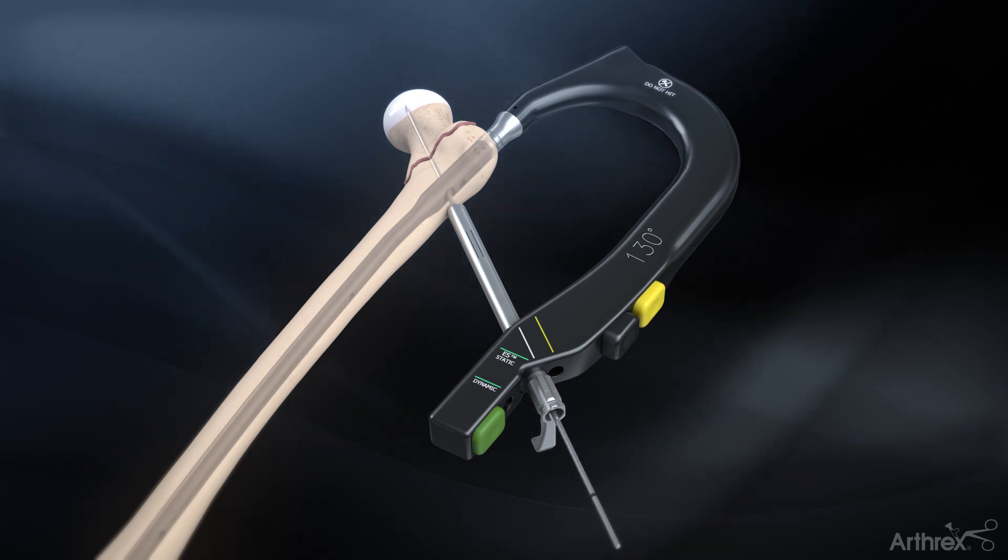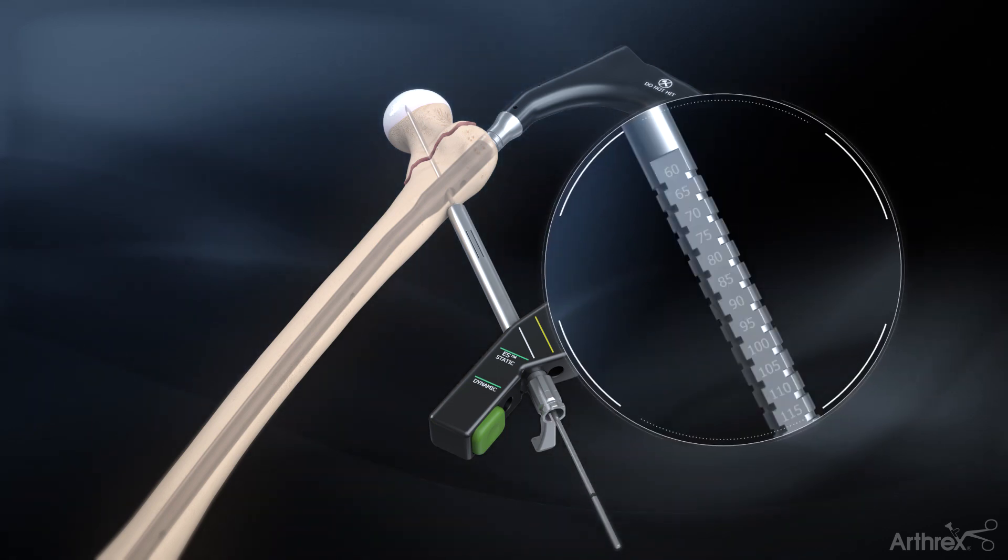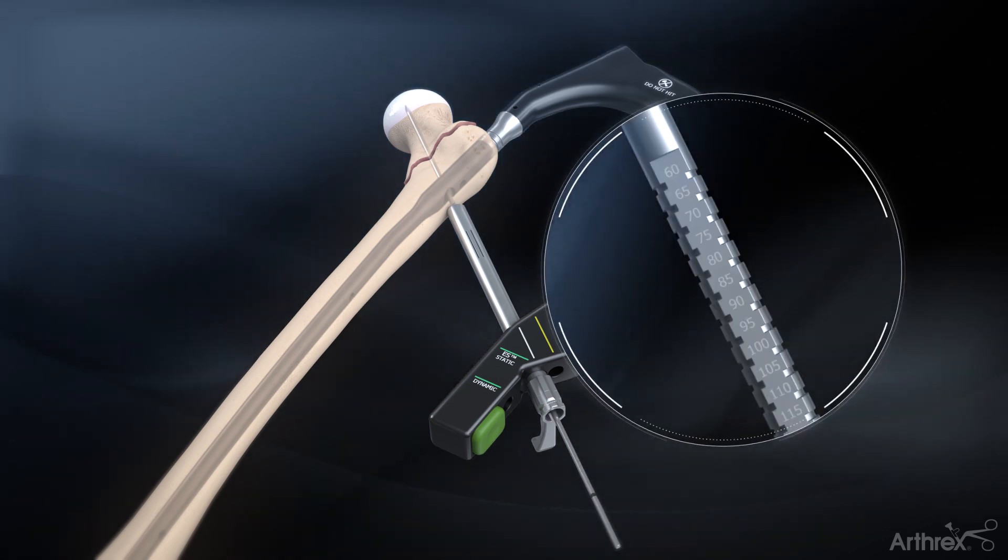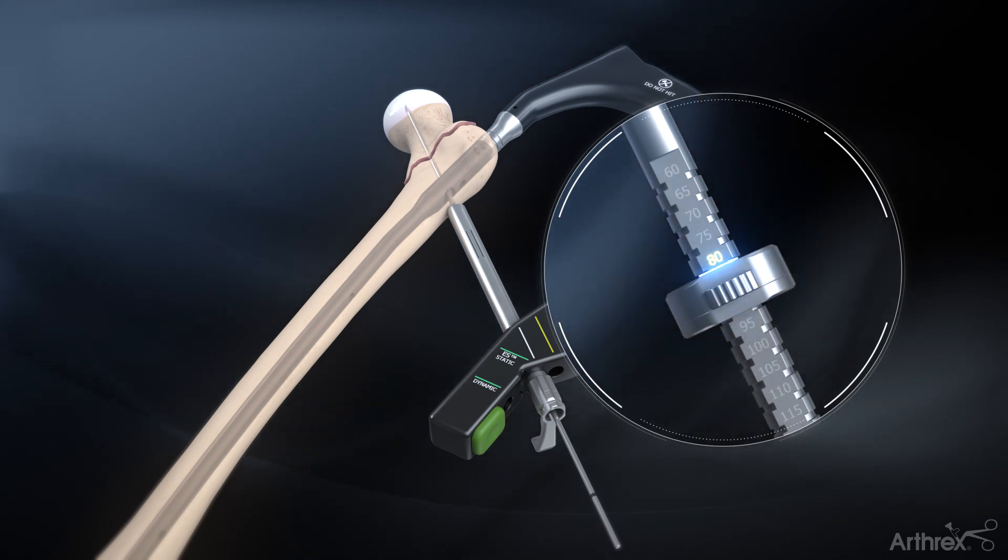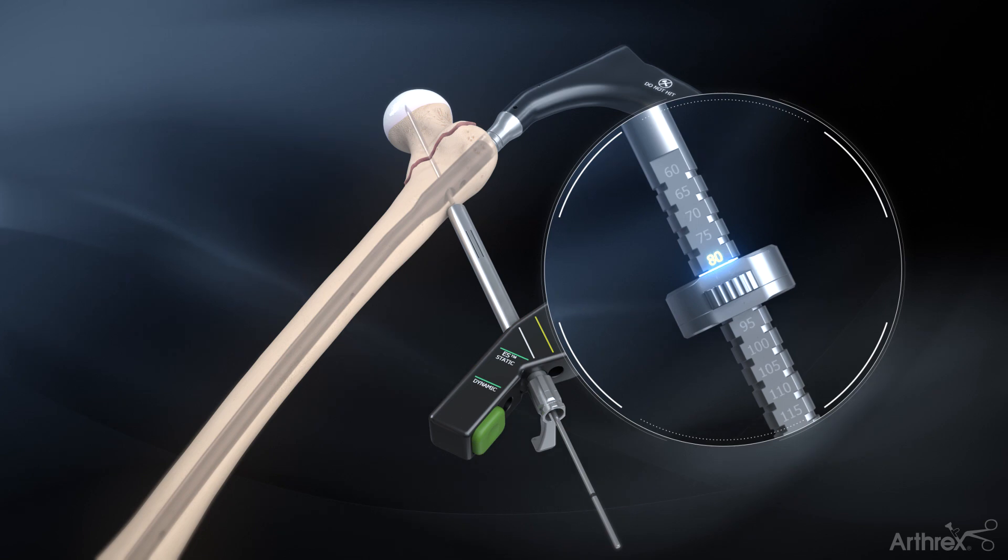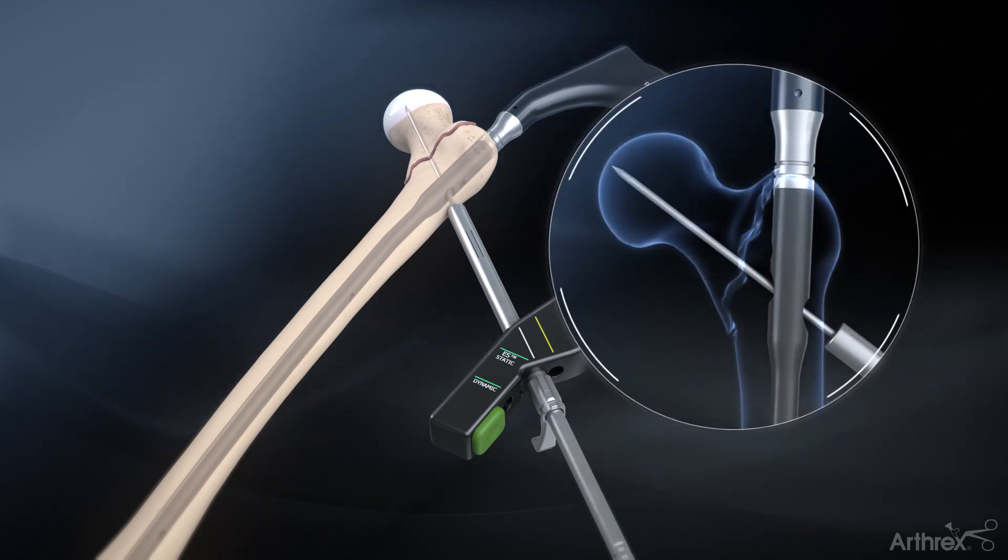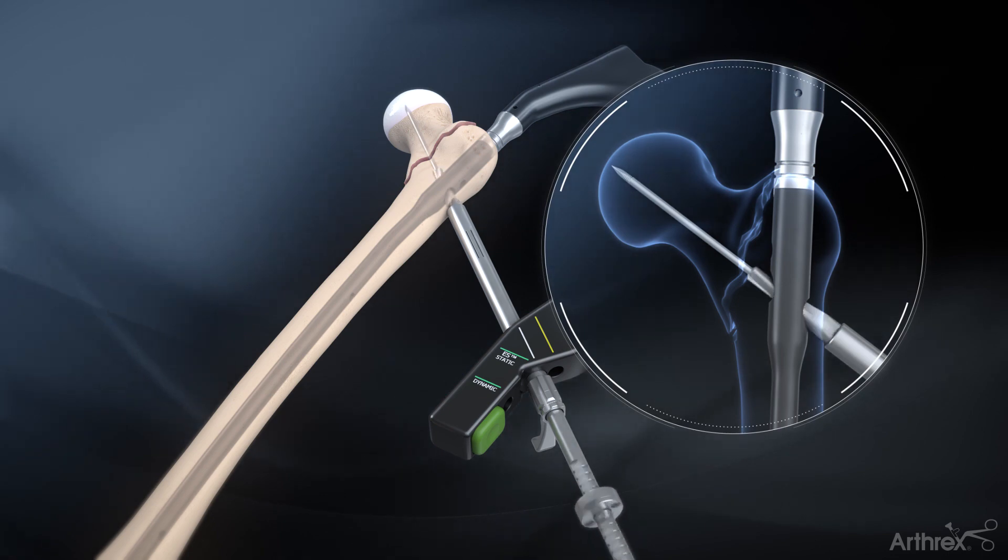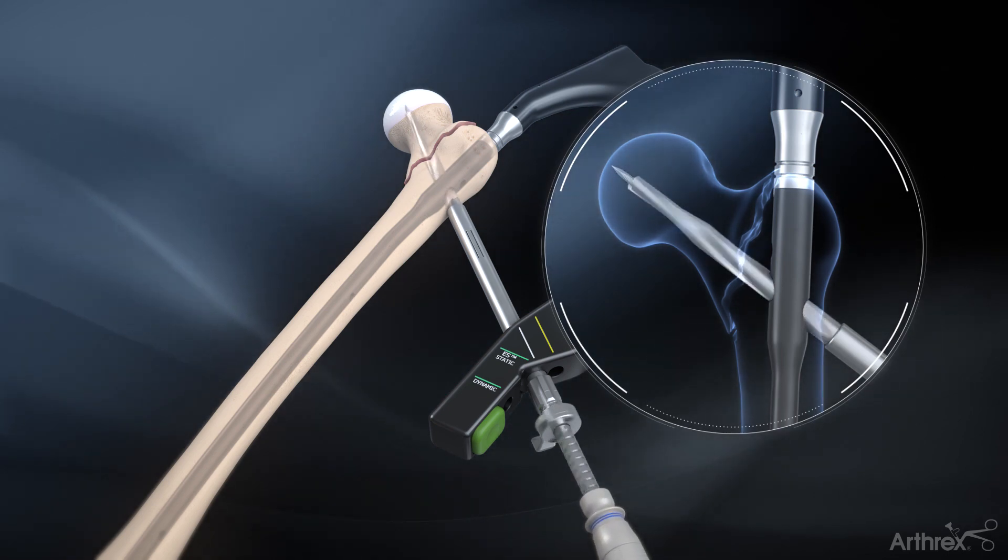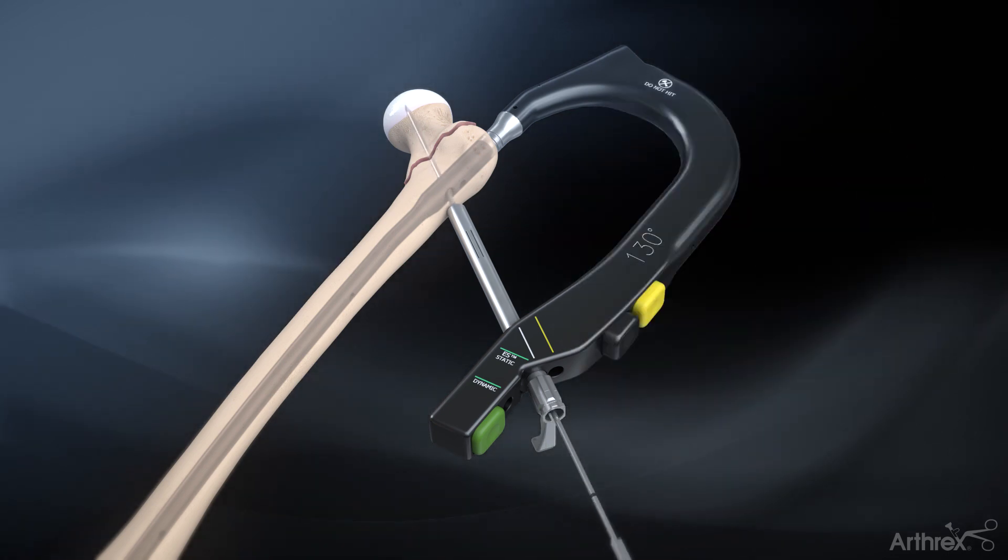Remove the 3.2 mm pin guide. Set the adjustable stop on the 10.3 mm cannulated lag screw drill at at least 5 to 10 mm less than the measurement, so the tip of the drill does not pass beyond the guide pin. Insert the 10.3 mm cannulated lag screw drill over the guide pin and drill into the femoral head until the depth stop contacts the sleeve.